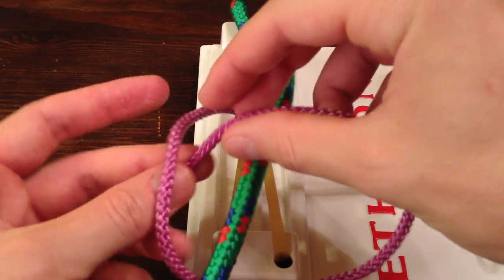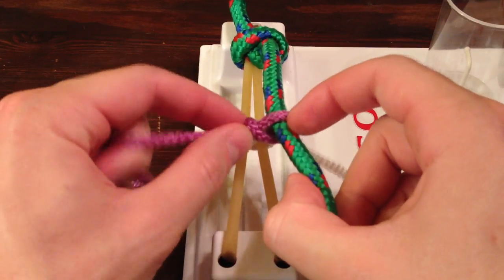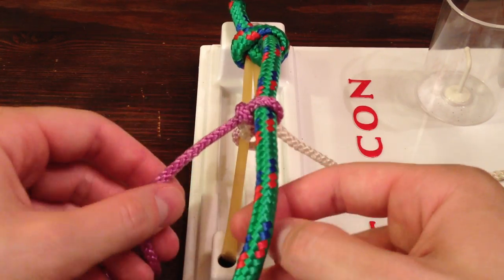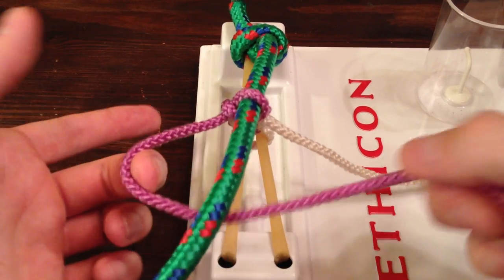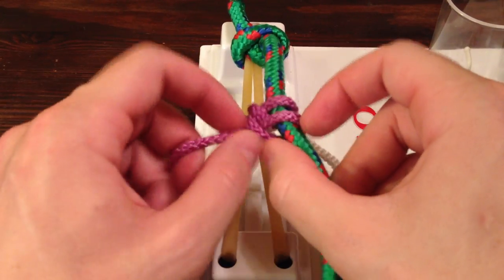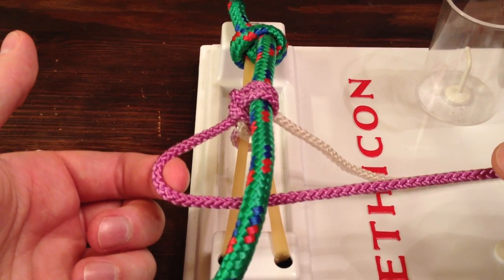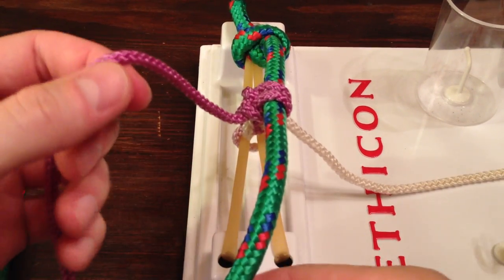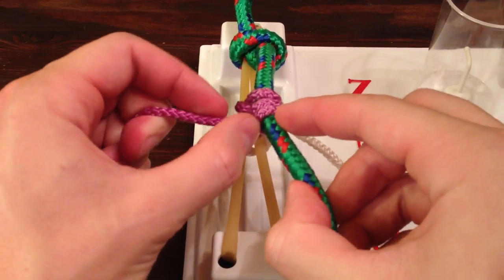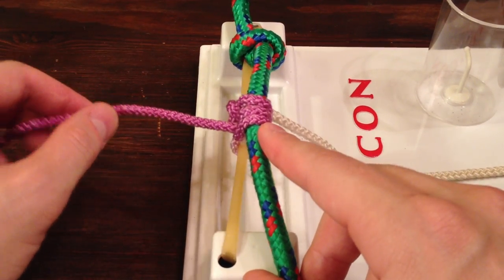You're going to take the top, stick it through the loop you created, and cinch it down to the knot. Again, you don't want to pull this super tight because you don't want to occlude the drain. We're going to tie three knots on each side. So that's one. Again, form the L — there's two. You can either tie the L for all of these knots, or if you're comfortable tying one-handed knots, you can tie a one-handed knot around the drain for all three. Whatever you do, you want to tie three knots on each side — one, two, three on the left.